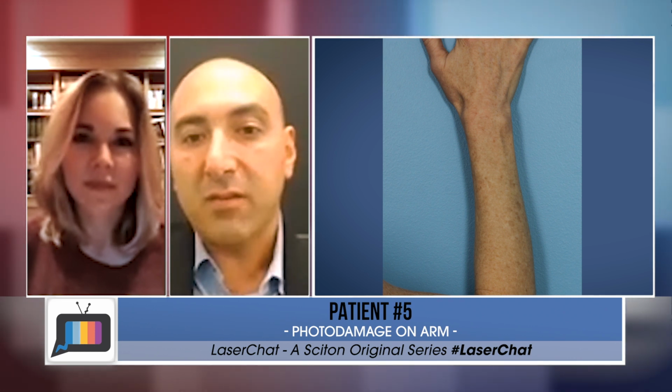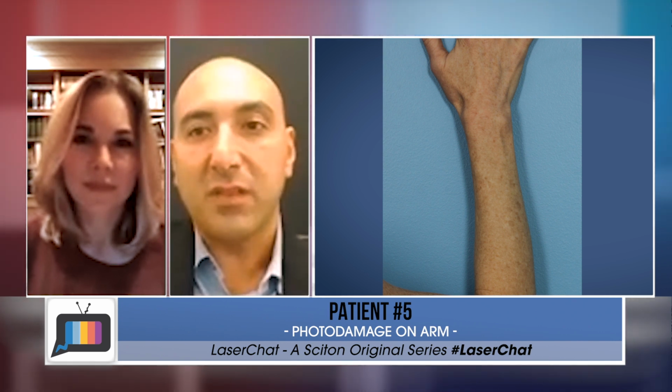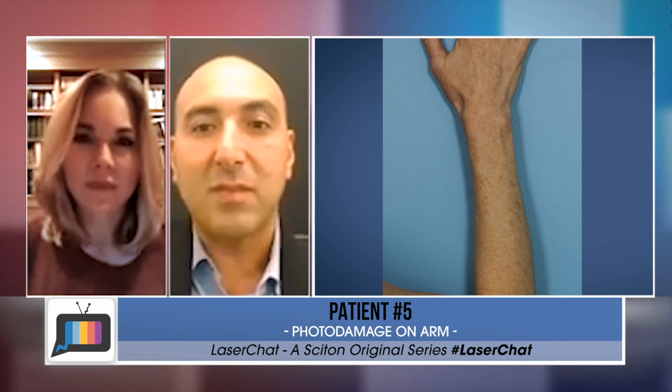Prior to BBL HERO, you would have to use a very, very conservative BBL. Otherwise, you'll get stamping on the forearms. And that almost always happens unless you're at very, very low energy. So with the BBL HERO, if I had my choice of anything, that's where I would start. Starting at about 5 joules, I think, would be plenty at the 3 millisecond pulse width. And just kind of gently going back and forth, almost like a little magic wand.